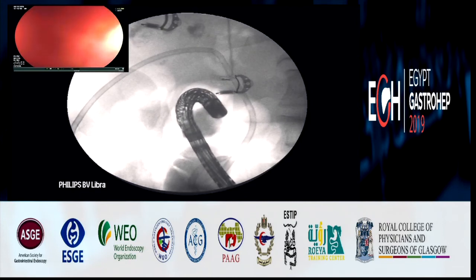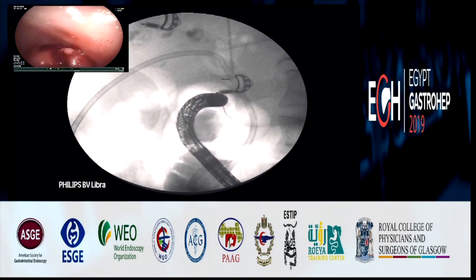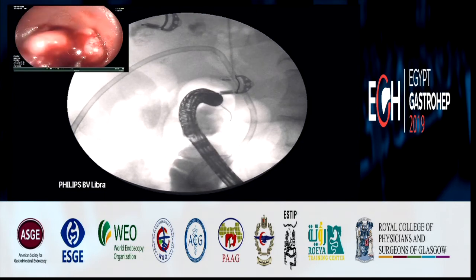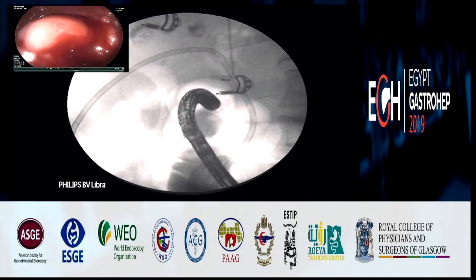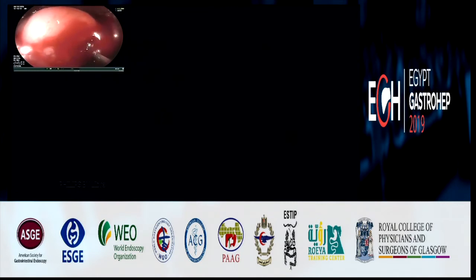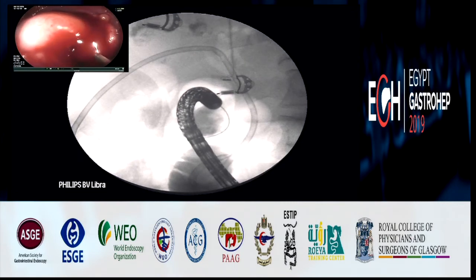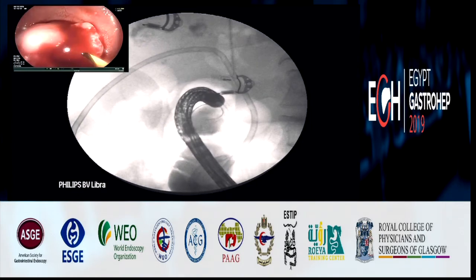It's a short wire. Okay, may I have the X-ray, please? X-ray. Could you engage your... The guide did not pass.